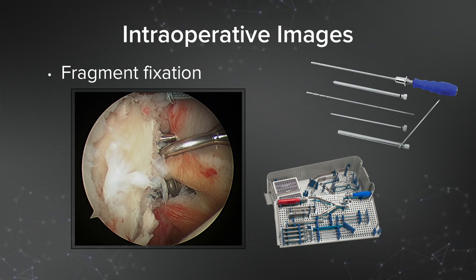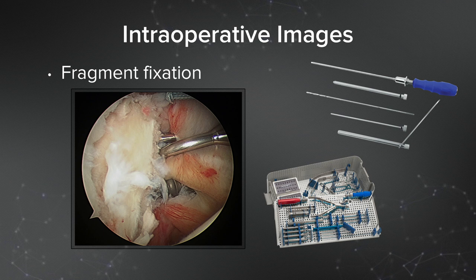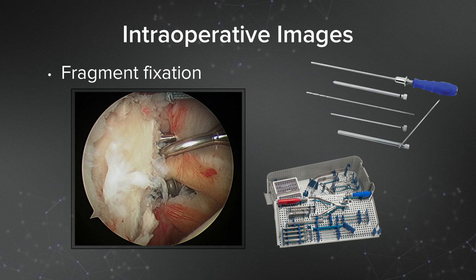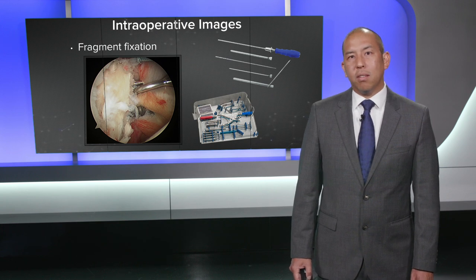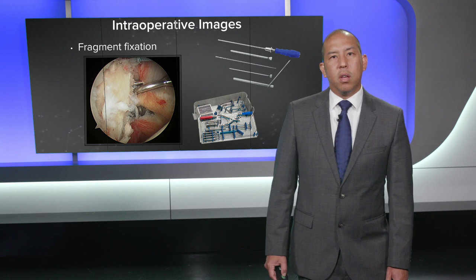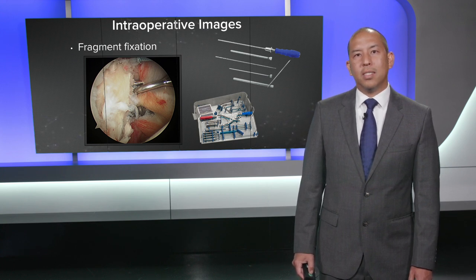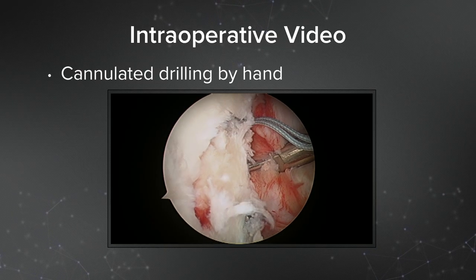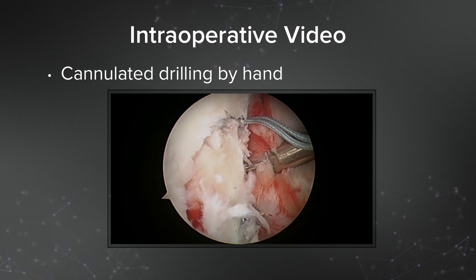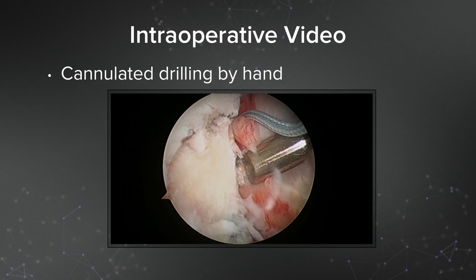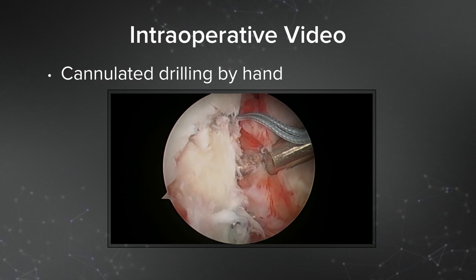Here is the fragment fixation. I place one suture in the anterior-inferior labrum to move the labrum out of the way for better visualization. Then I have the suture lasso in place, have it pinned, and put two K-wires. These portals and K-wires are placed percutaneously using needle localization. The glenoid bone loss set has a very long nesting guide that's perfect for this. Here is video showing cannulated drilling by hand — I have a freer elevator in place to retract soft tissue, and I'm gently drilling over the K-wire so as not to shift or disrupt the fracture.